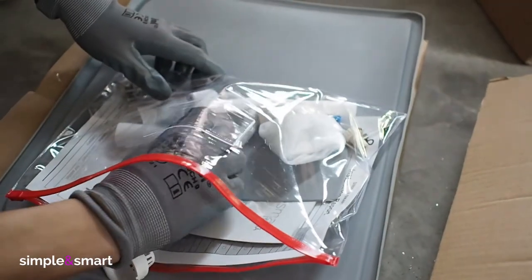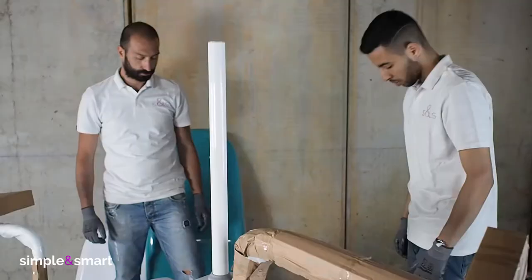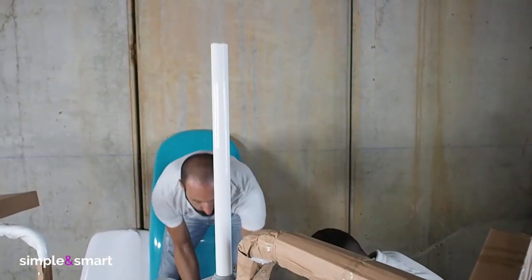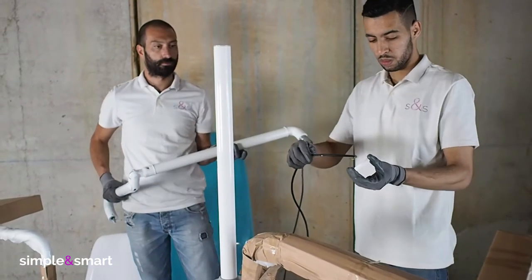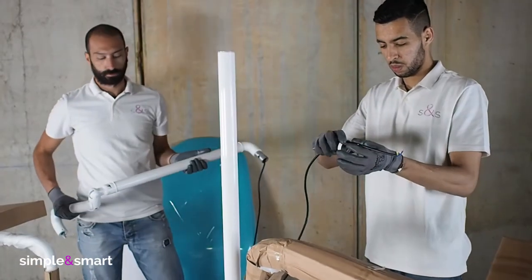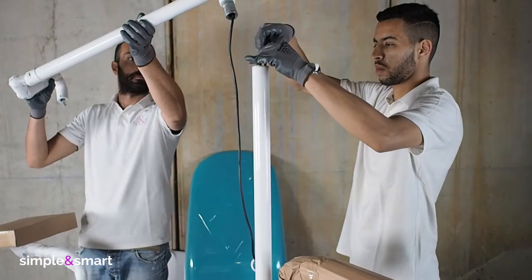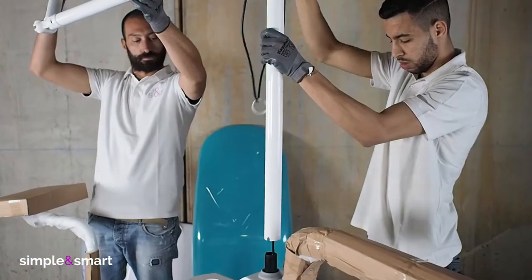Place it on the lamp vertical pole to cover the joints at the base. Use the white plastic ring to join the lamp's arm to the lamp's pole.